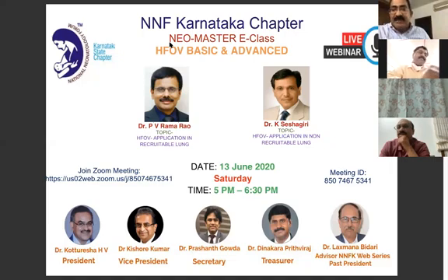So I have SensorMedics with me. This child has bad meconium aspiration syndrome. The saturations were sitting in the 80s and the CO2s are something in the 70s or 80s. So I get this baby onto the oscillator, the high frequency SensorMedics. What is important here is it should give me a feel.